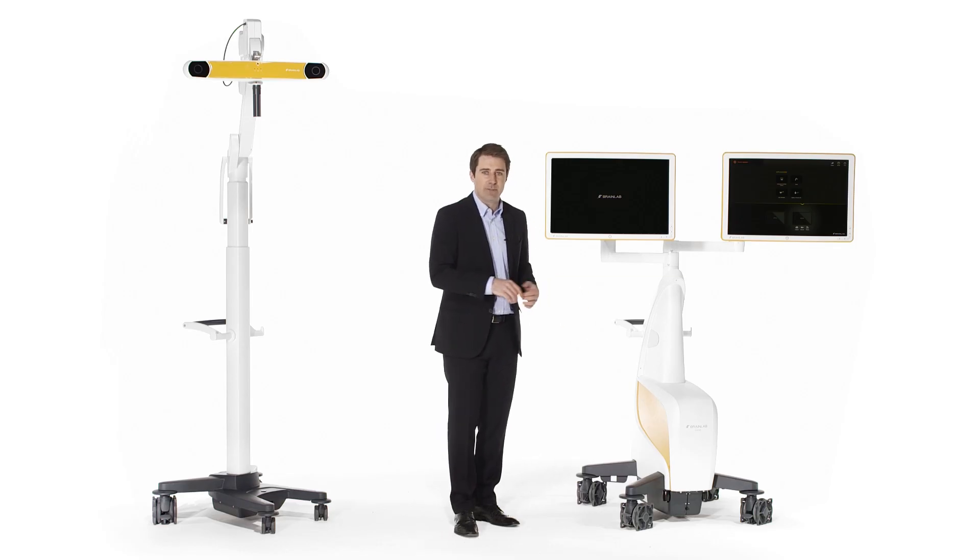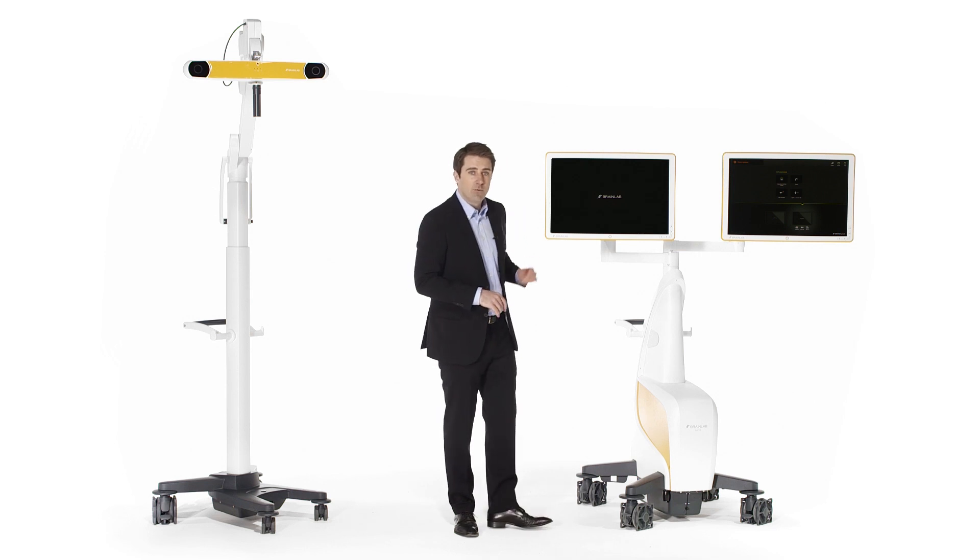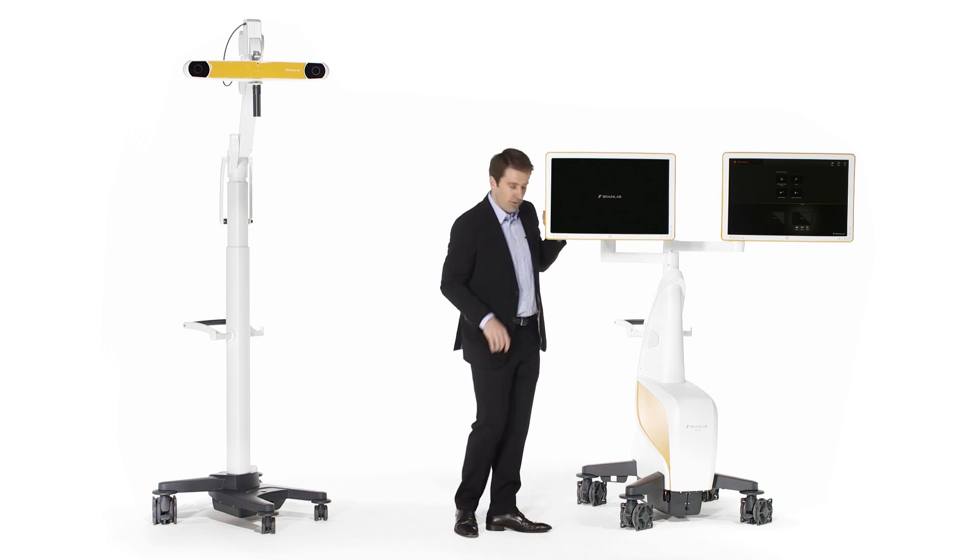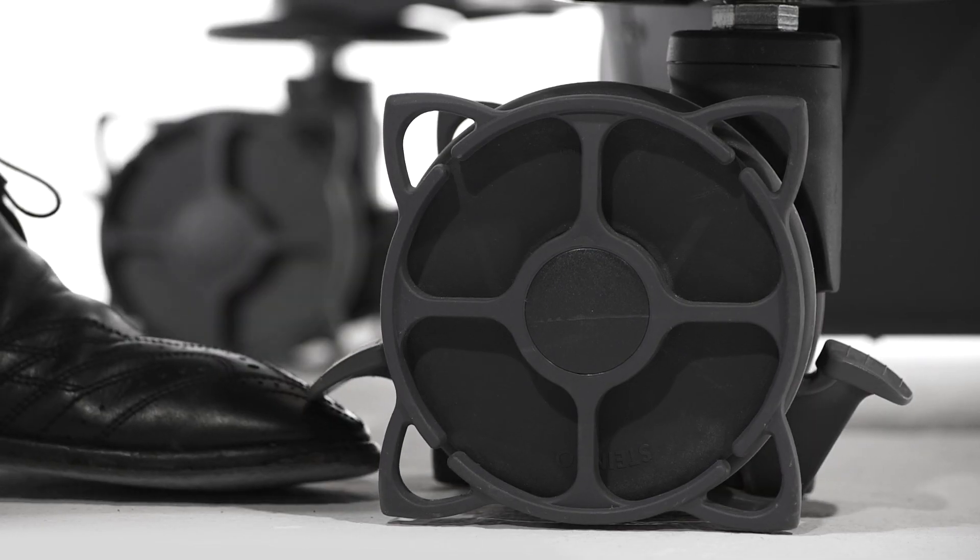The eight wheels pivot independently and come equipped with brakes on both sides for easy access.